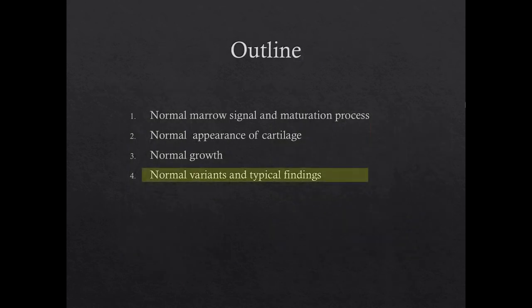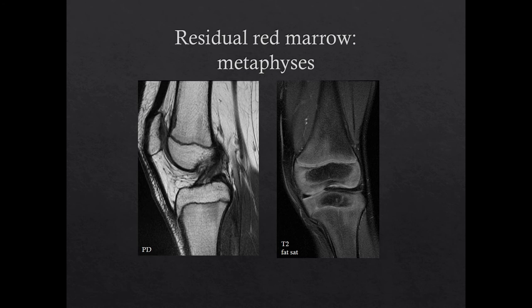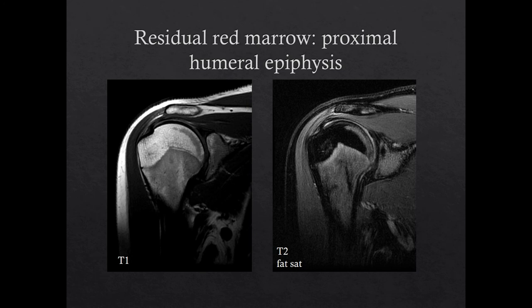Next, we will move on to a discussion of some normal variants and typical findings seen in pediatrics. Seeing residual red marrow is a frequent occurrence in pediatric musculoskeletal MR imaging. It is good to be aware of certain locations where this more commonly occurs. It is common to see residual red marrow in the axial skeleton and in the metaphyses, which are the last places in a long bone to convert to fatty marrow. Two other common locations are the proximal humeral and femoral epiphyses and within the bones of the feet. Here is an example of residual red marrow in the metaphyses of two different patients, showing the typical linear or flame-shaped appearance, which is perpendicular to the physis and non-mass-like. Here is an example of normal residual red marrow in the proximal humeral epiphyses, with a typical crescent configuration along the medial aspect of the epiphyses. This should not be confused with avascular necrosis, which would demonstrate flattening or collapse.